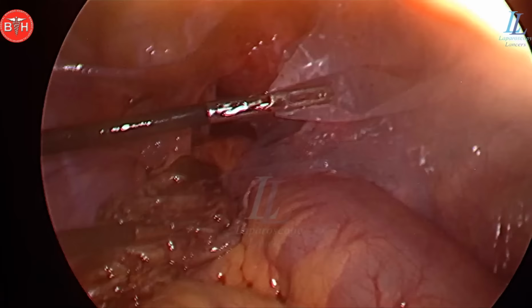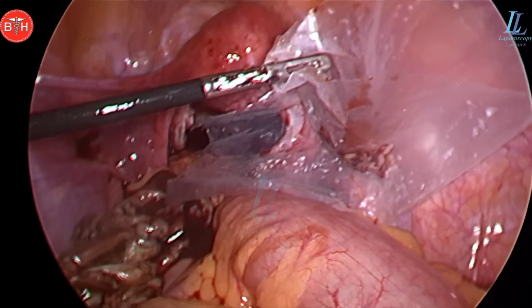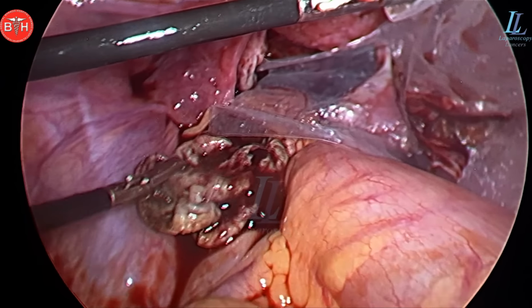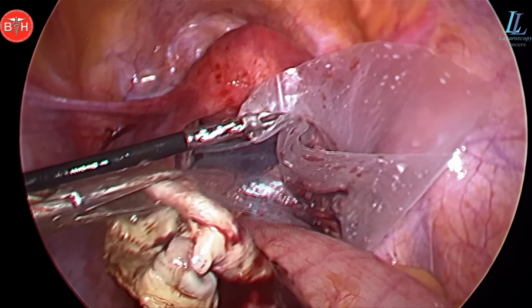And there I have put in an improvised endo bag. Please tell in the comments what that endo bag is made of. I repeat, what is that endo bag of? Obviously it must have been a container for something else.